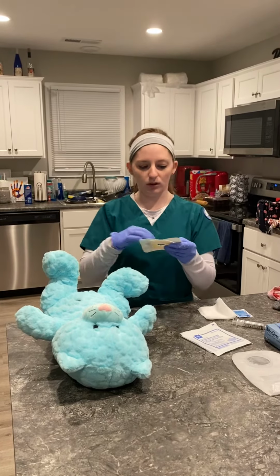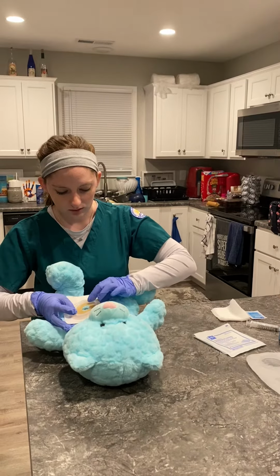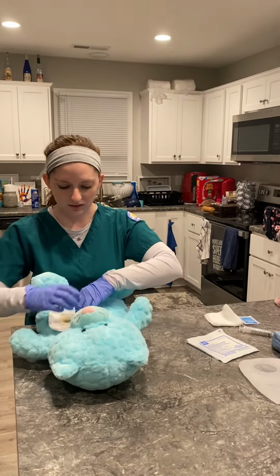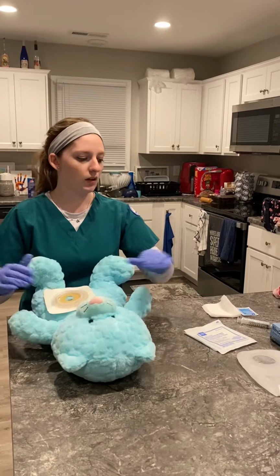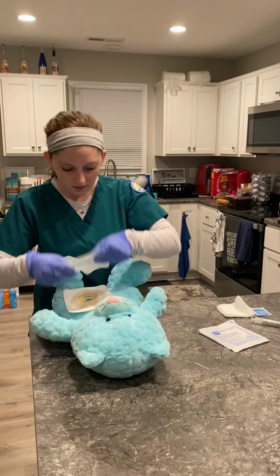Peel the wafer part off. Place that on there. Making sure it's a good fit and tight. Sticking it down, and then I'll peel the edges off and stick it as well. Making sure there's no gaps that air or leakage could get through. Then I take my bag and I'm going to just pop that right on there.